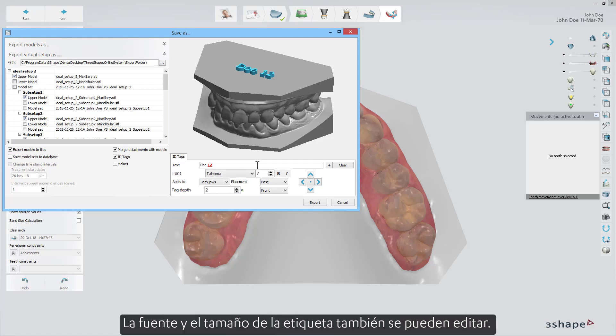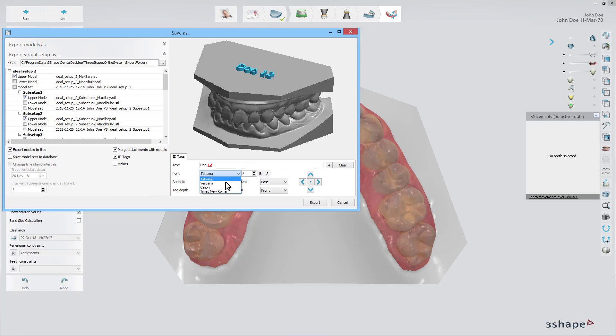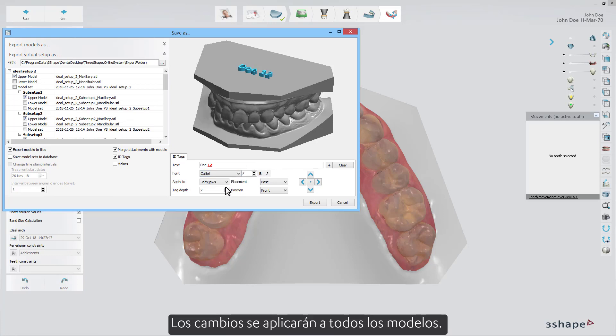The tag font and size can be edited too, as well as the depth of the text, which can be negative or positive. The changes will be applied to all models.